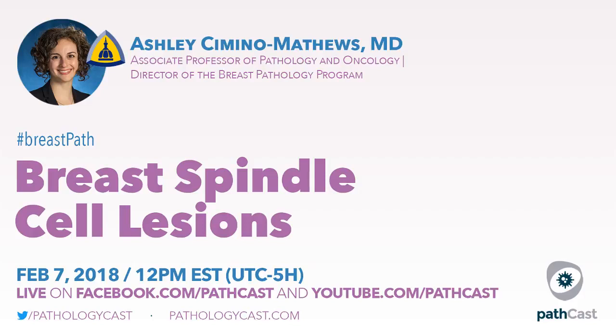Sure. So the question is, can we differentiate a malignant phyllodes tumor where no low-grade component can be identified from a primary undifferentiated sarcoma? That's a very good question. And just to make sure everyone heard it, can we differentiate between a malignant phyllodes tumor where there's no associated low-grade or leaf-like component and a primary undifferentiated sarcoma of the breast? By morphology and immunohistochemistry, the answer is no.